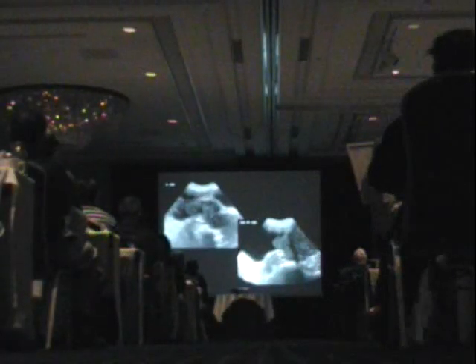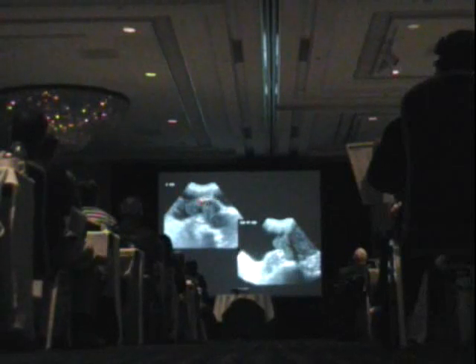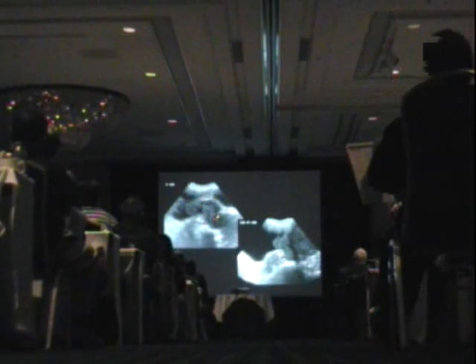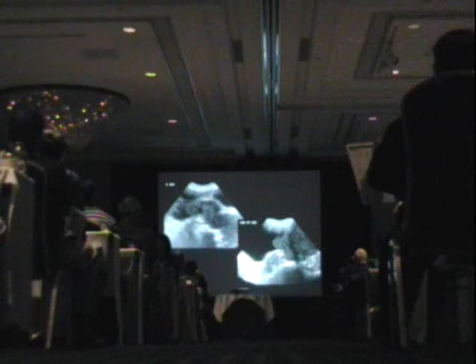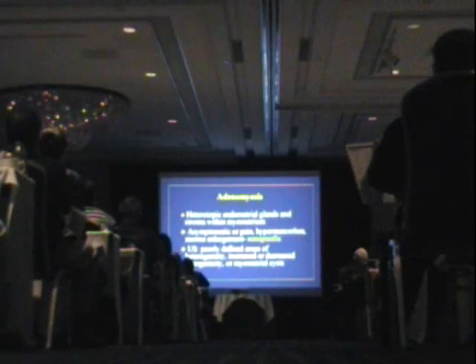And then looking out in the adnexa, this is again full bladder, here's bladder here. You can see these solid masses as well as free fluid. And then on the other side, or this is a little bit higher, here's an ovary here, but a solid mass, and this is that big solid mass and lots of free fluid. And she went to the OR and was found to have a sarcoma, uterine sarcoma.